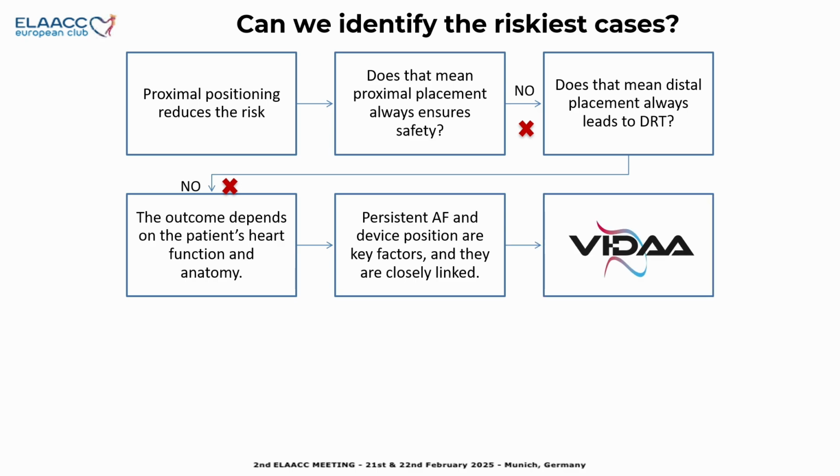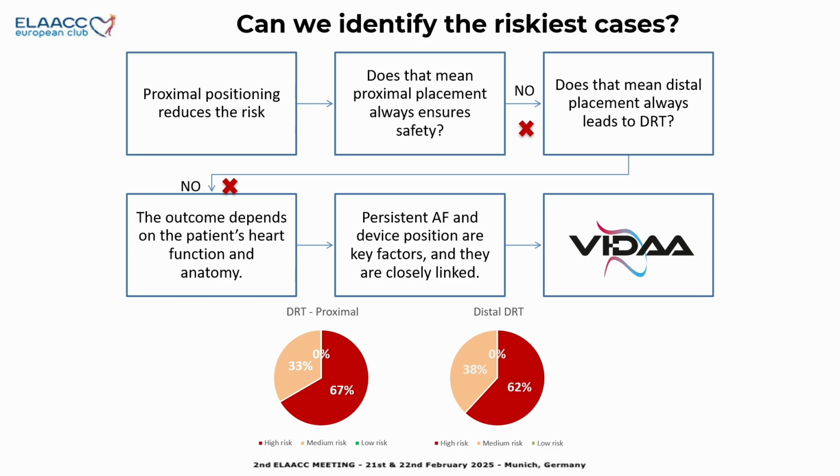And all this we can do with the software that I use, which is VIDA, and it's not only, as I said, flow simulations, but also adding clinical data and anatomical factors so we can stratify the patients better. In the IDEAL study, all the DRT cases were classified as medium risk and high risk, none of them low risk. So I think that in the end, we came up with a good assessment of the patients.